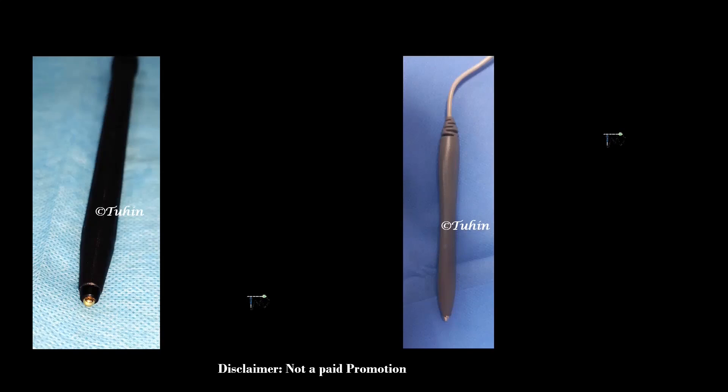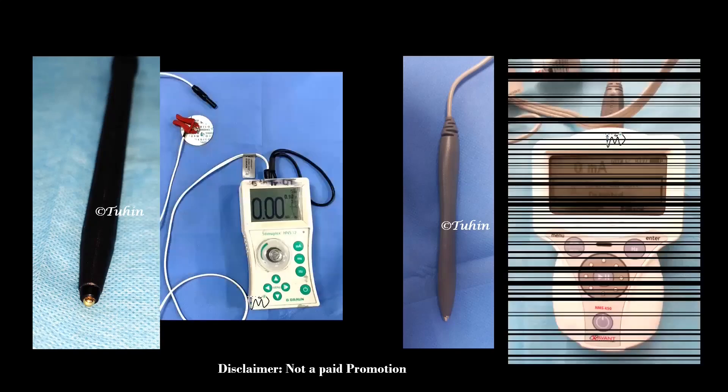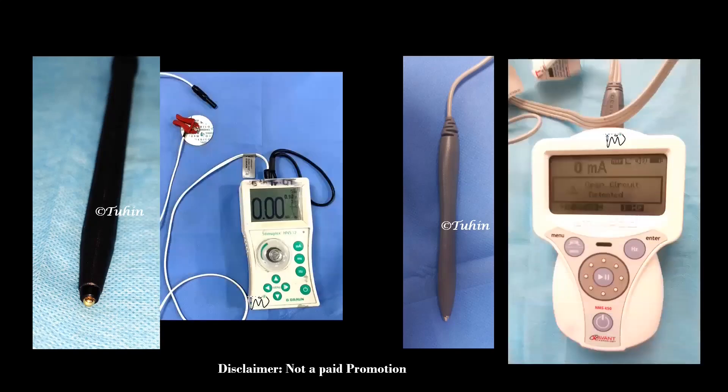It helps us to localize a superficial nerve before performing a PNS guided peripheral nerve block, like the way we do a scout scanning before doing an ultrasound guided peripheral nerve block. This device connects to a peripheral nerve stimulator, enabling nerve mapping without puncturing the skin. It can be used to locate a superficial nerve up to a depth of approximately 3 cm.